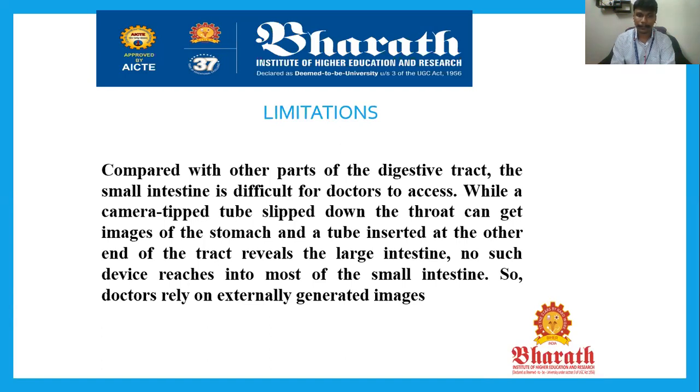While a camera tipped tube slipped down through the throat can get an image of the stomach, and a tube inserted at the other end reveals the large intestine, no such device reaches most of the small intestine, so doctors rely on externally generated images. They say it is very hard and complex to capture the small intestine area.